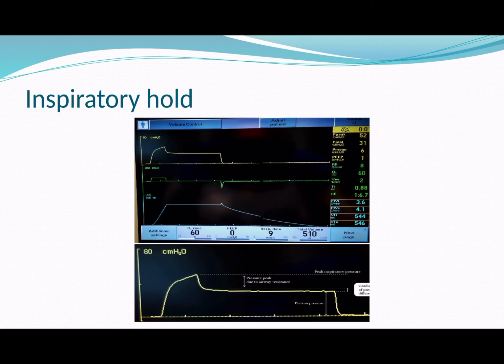Do an inspiratory hold, see what the plateau pressure is. You can see that value in the top right-hand corner of the screen, where it says P plat. That is the value that you want to use as your starting PHigh pressure.